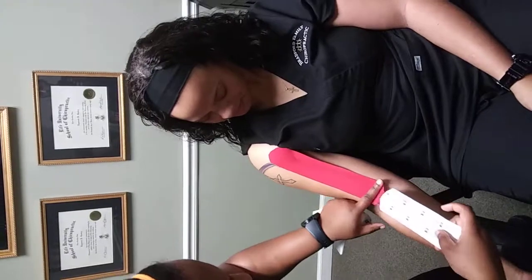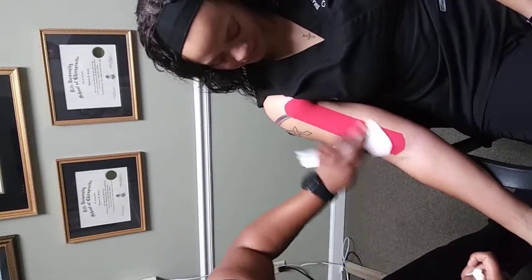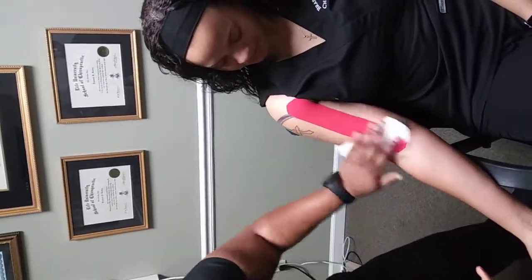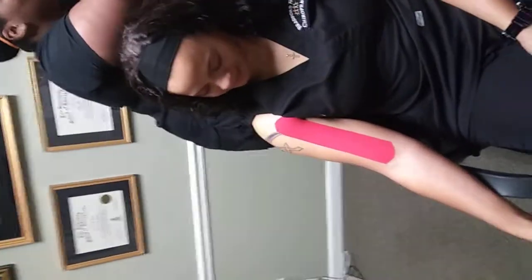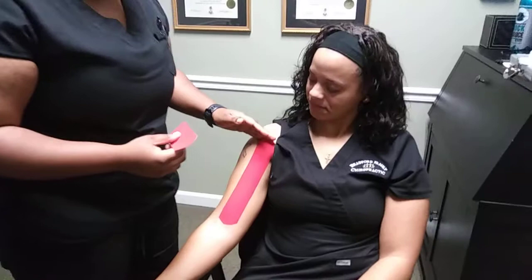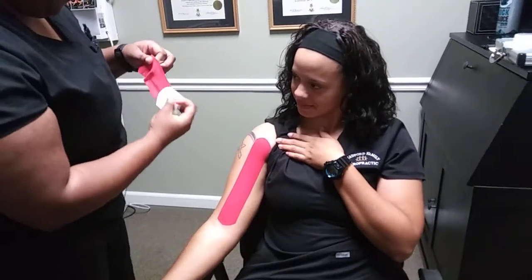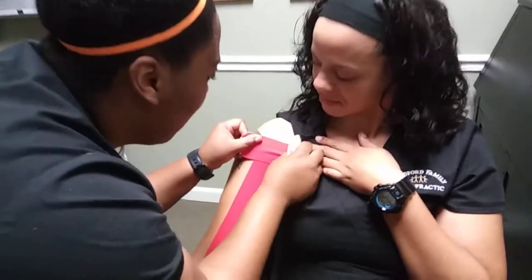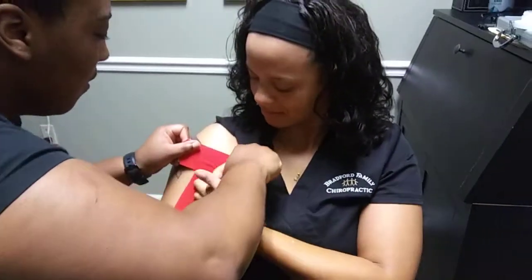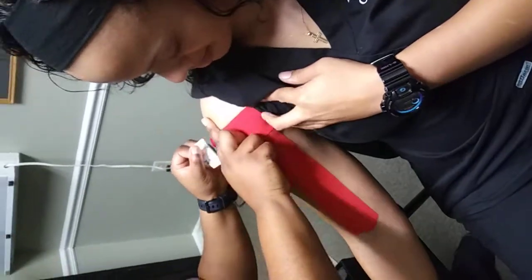You just want to lay it down, activating the adhesive on the tape. This tape is for the inflammation, so we're going to lay it across. I'm going to stretch the tape about 100% and back off 50.